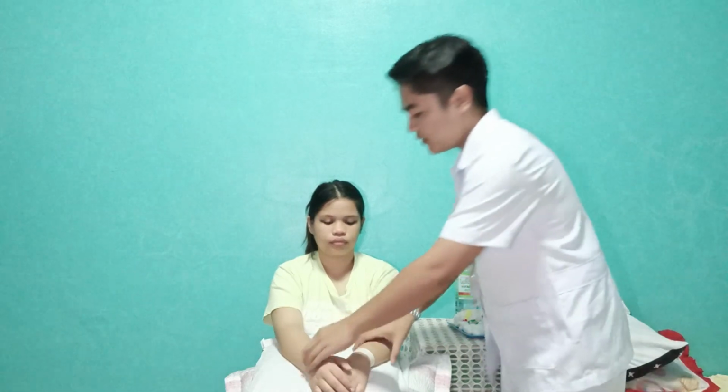Since the patient is sitting, I'm going to need to make sure that both of her feet are on the ground, because the blood pressure increases if the legs are crossed. And I'm going to have to place her arm at the heart level, because if the arm is at a lower level, it would give us a higher blood pressure reading, and if the arm is at a higher level than the heart, it would give us a lower blood pressure reading.